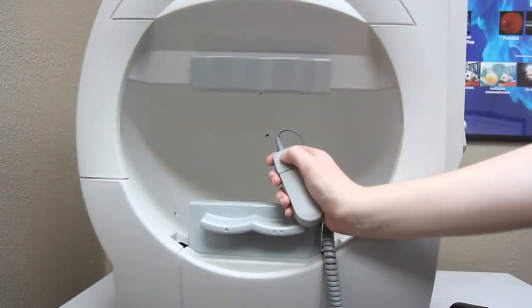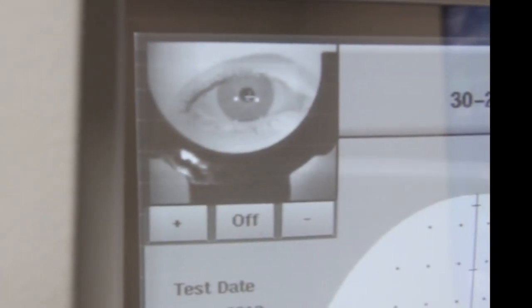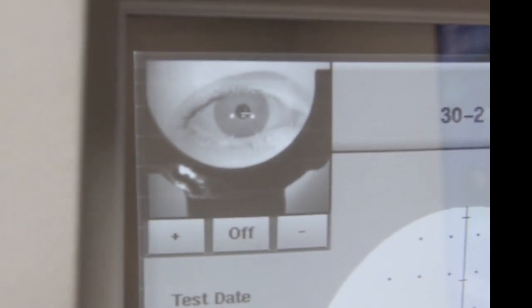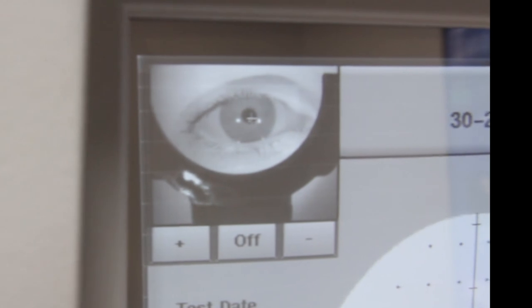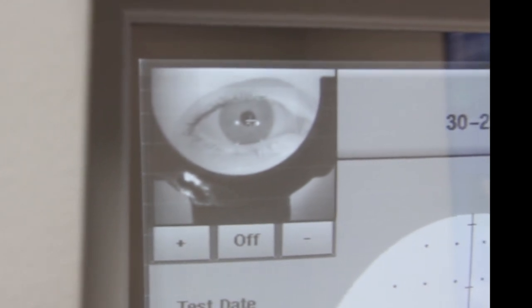Hold the button down to pause if you need to rest or if your vision starts going gray. Blink your eyes normally during the test. The best time to blink is right after the light flashes so you don't miss the light.